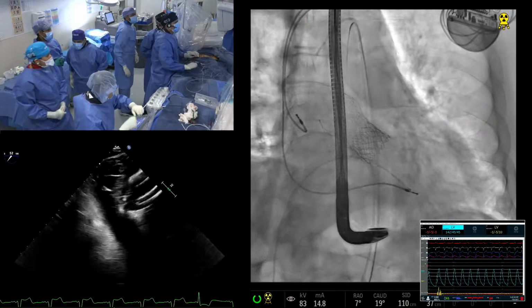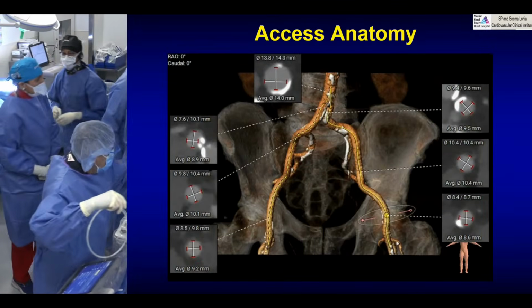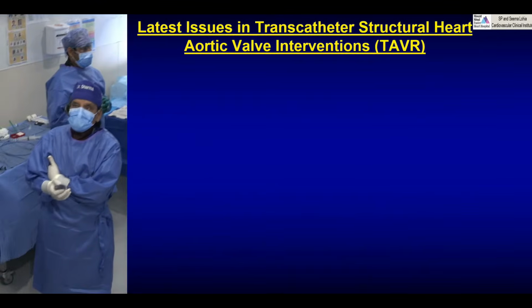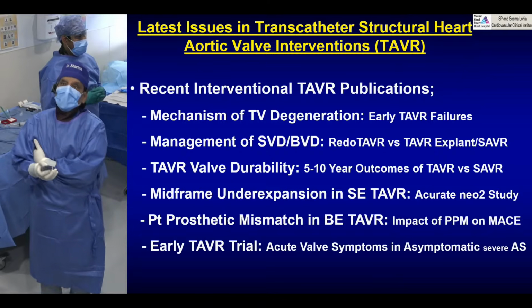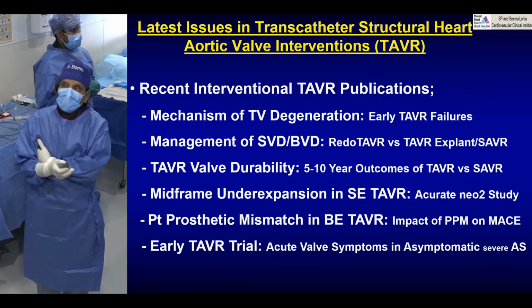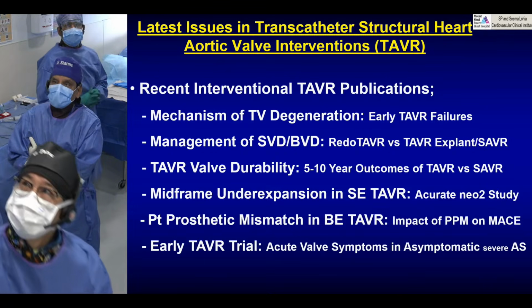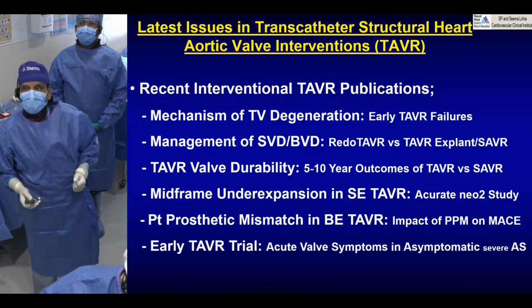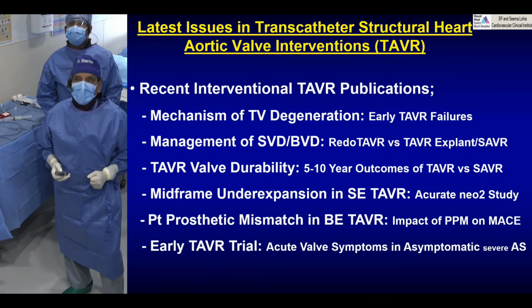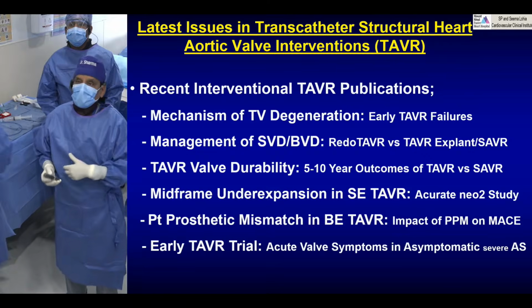All right, so let's go to our continued presentation. The case-wise, we have done a tremendous job with everybody's input, and we thank our audience also for keeping us on our toes, and that is what the discussion will be today. About transcatheter valve degeneration, early TAVR failure, management of structural valve degeneration, and of course bioprosthetic valve degeneration, redo TAVR versus TAVR explant, TAVR valve durability, mid-frame underexpansion in self-expanding and patient-prosthesis mismatch in the balloon expandable.